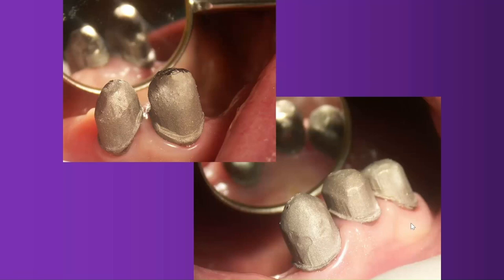We wanted to have the best friction possible with a removable component that was also gold palladium, in order to get the best friction possible. Those telescopes now have to be retouched, which is a very, very difficult thing to do. Three teeth on one side, two teeth on the other side, and the telescopes. Now we have to make them mirror shine, but they have to be absolutely parallel, 0 degrees.